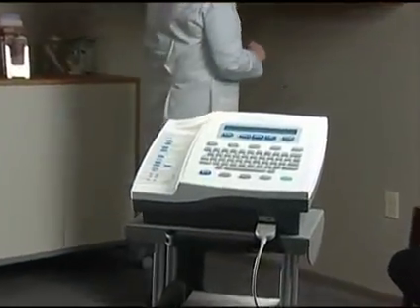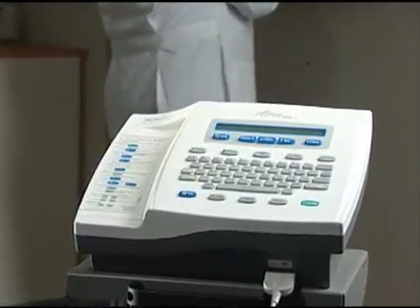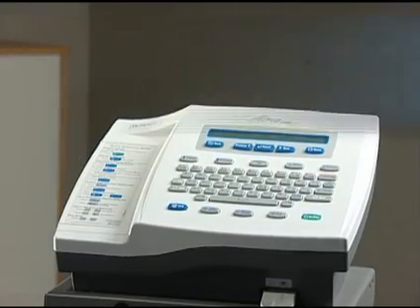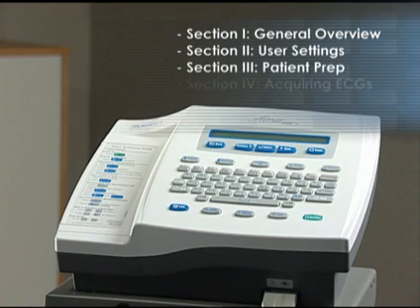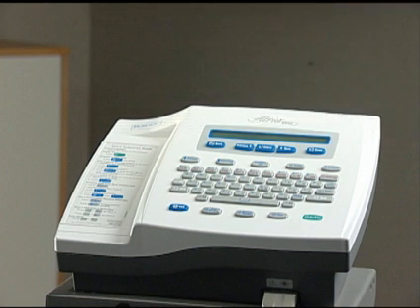In no time at all, you'll be able to set up your new device and start acquiring timely, accurate, and reliable ECG results. This 10-minute training session includes a general overview of the Atria 3100, information on the user settings, patient prep overview, and details on acquiring ECGs. Let's get started. First, we'll cover the basics of setting up and using the Atria 3100.